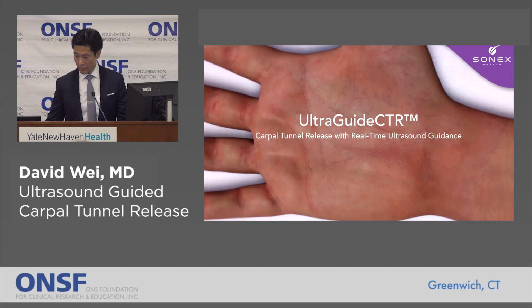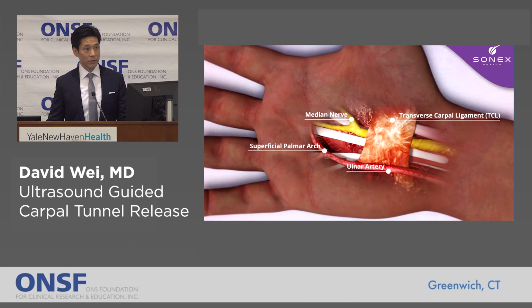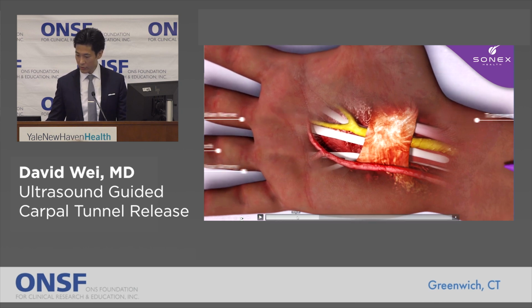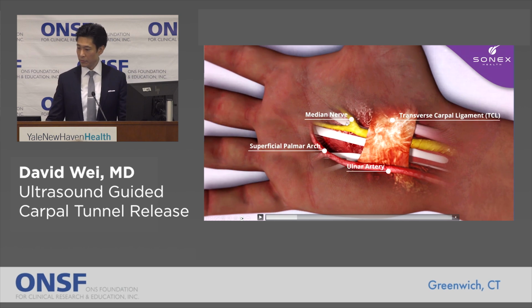So I'm going to take you through this diagram. So this is essentially what I'm doing when I use this technique. I identify the major structures, so I'm going to point them out to you just so you have a sense of what those structures are. The transverse carpal tunnel ligament, which we've already talked about, the median nerve, which is this yellow structure. Importantly, we also look at the ulnar artery, and this is something that has changed as well. We used to never pay attention to this artery, but sometimes it's very close to that ligament.